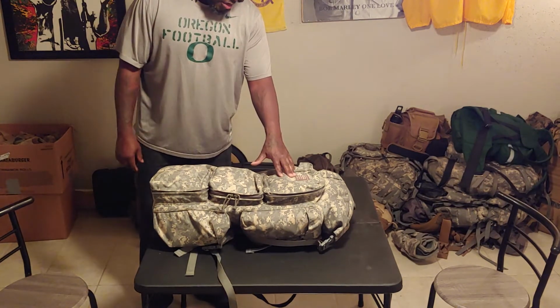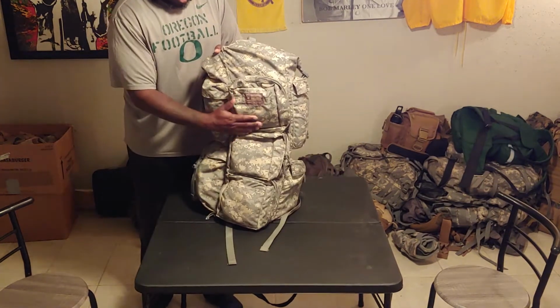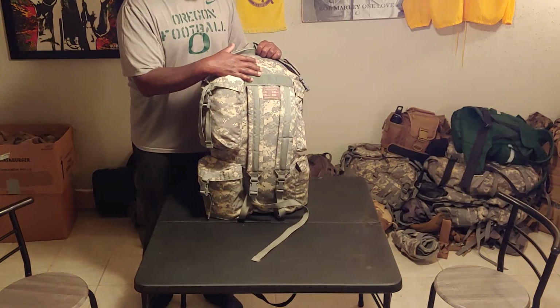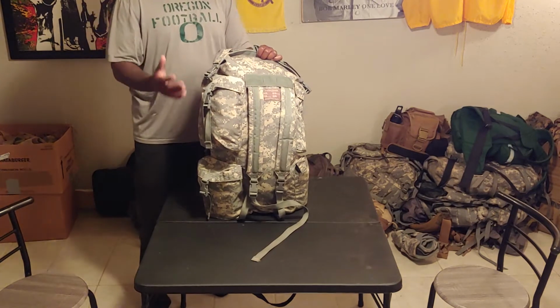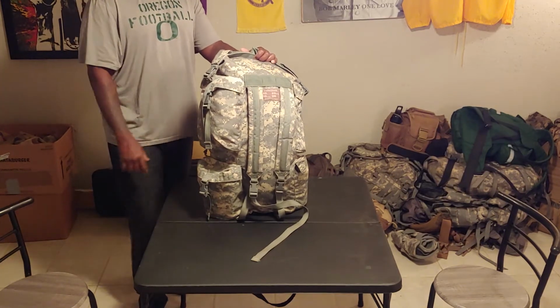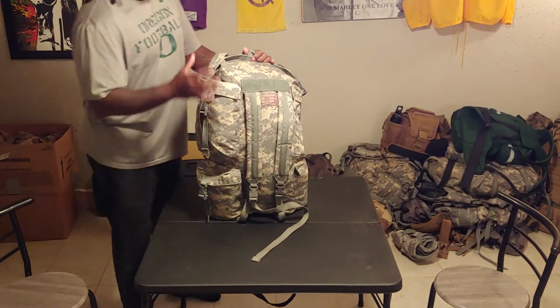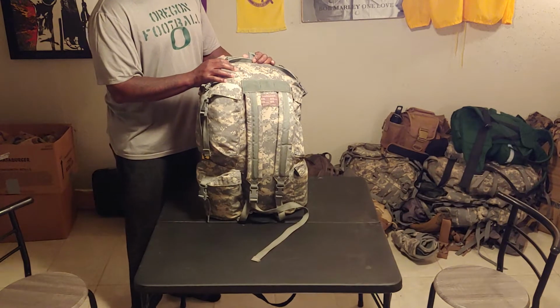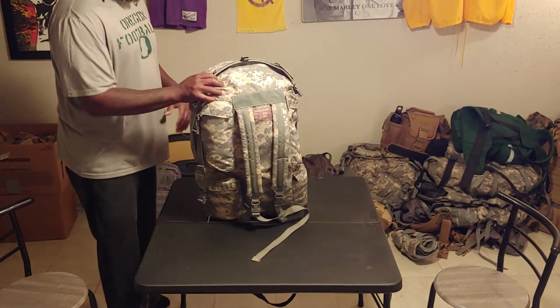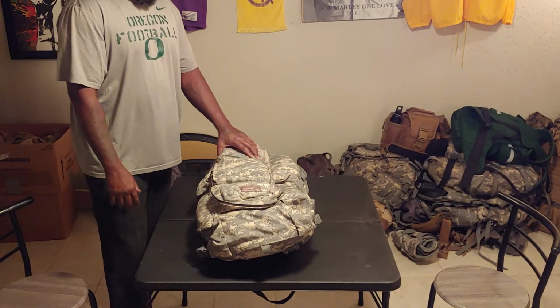The medical personnel with the assault team, if someone was injured, this is the bag that they had. This bag carried all of their trauma gear, and it also carried a litter. A litter, I don't know how I would describe it, but it's I guess the walking gurney that you use if someone's injured real bad and they can't walk. It would take a team of about 4 people to pick up and carry them out. I don't have that. I thought about getting it, but the prices on those are anywhere from $150 to $250. I just don't feel like spending the money on those right now. So we'll just go through the bag and I'll show you what I have in there.